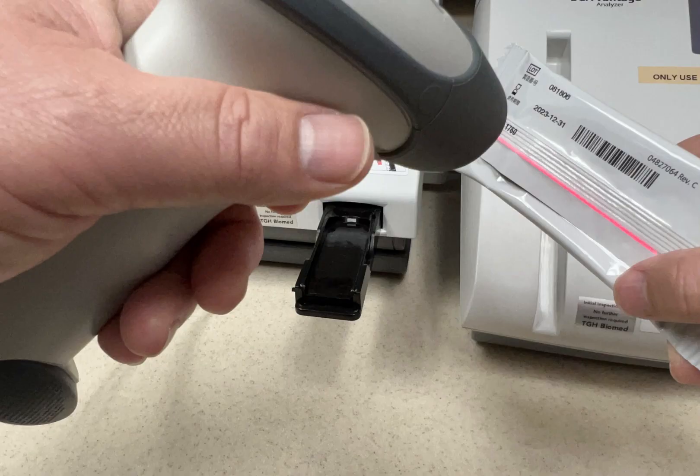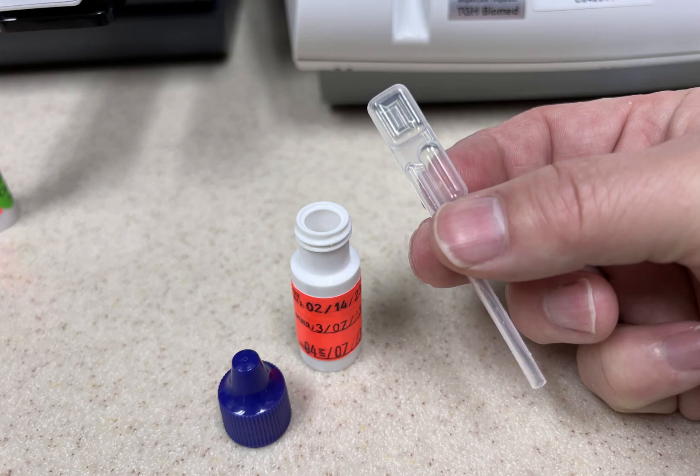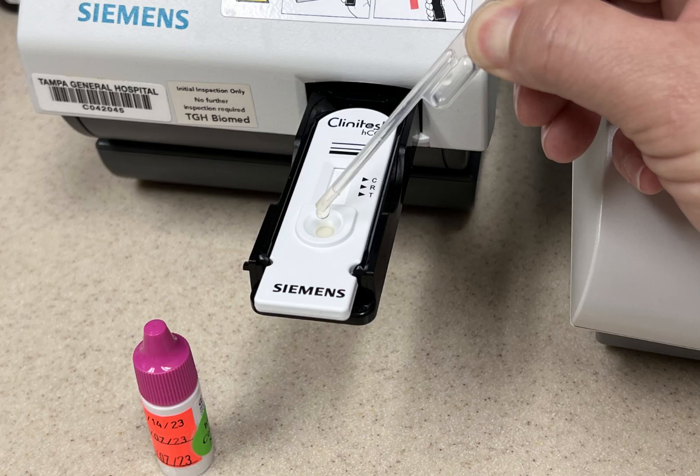Click on enter new lot and expiration date. Scan the barcode on the cassette package. Open the package and place the cassette on the tray. Remove the pipette from the package. Open the sample control by squeezing the square end of the pipette, suctioning the sample from the vial. Squeeze the pipette into the cassette round receiver.